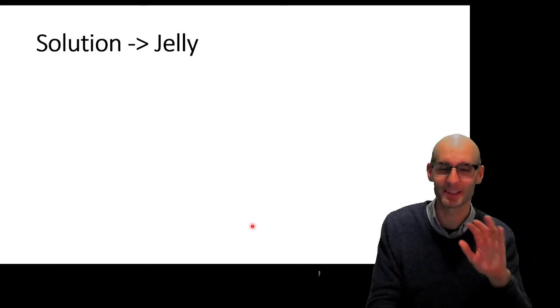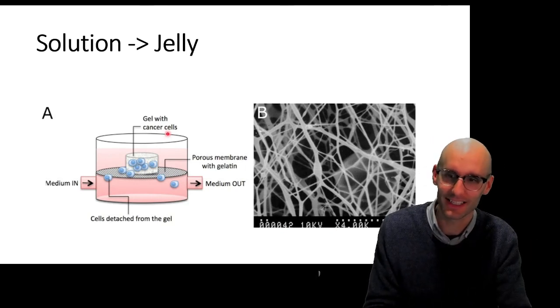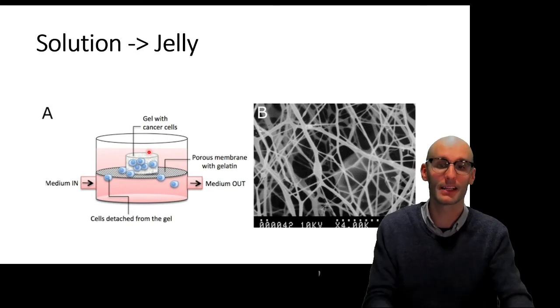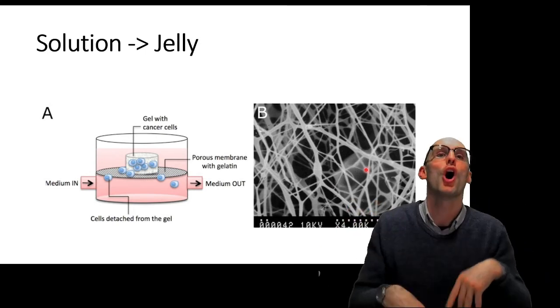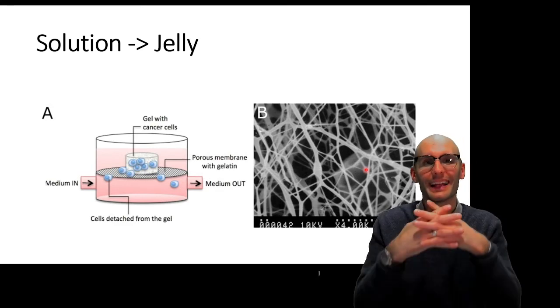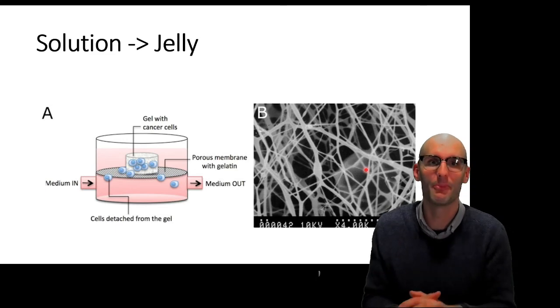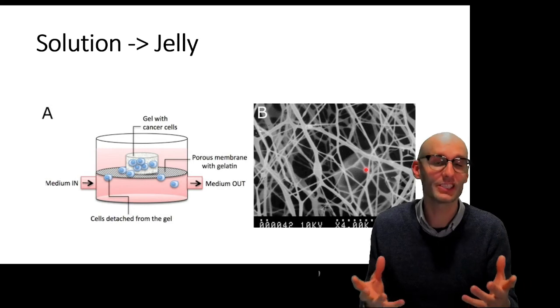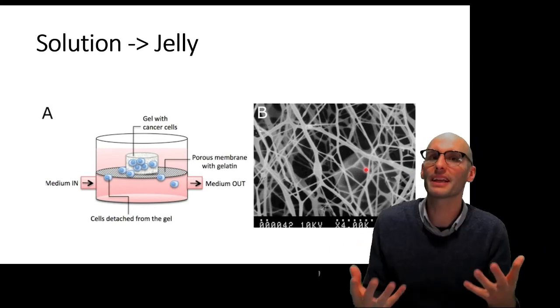Now, this is a growing field. It's very cool, and it's made some amazing discoveries. And essentially, it's jelly, right? Like gelatin with cancer cells in it. So you can create these extracellular networks. Here's the scanning electron microscopy of it. So you can see it's a mesh of proteins, glycosylated proteins and polysaccharides, exactly like your extracellular matrix, also exactly like literally jelly, because jelly is made essentially from extracellular matrix. So essentially we can grow cells in jelly, in extracellular matrix, to replicate that 3D environment.